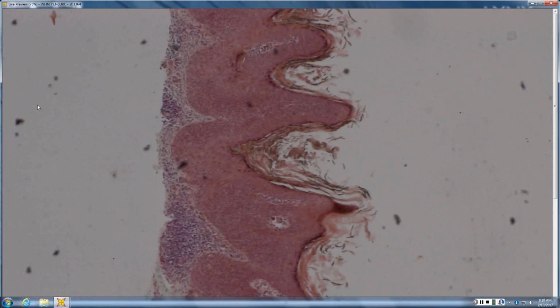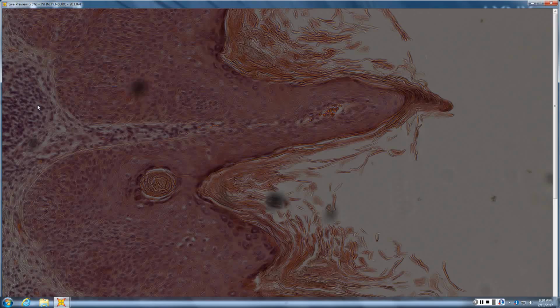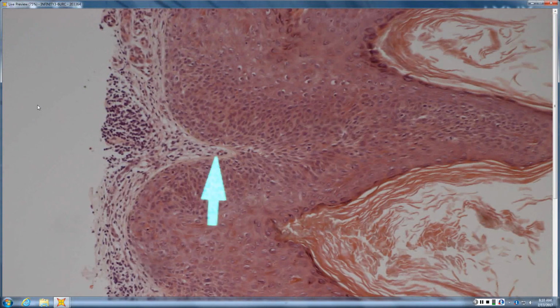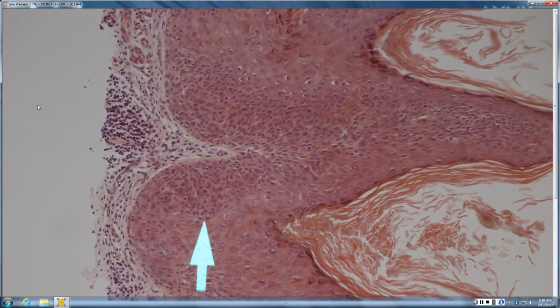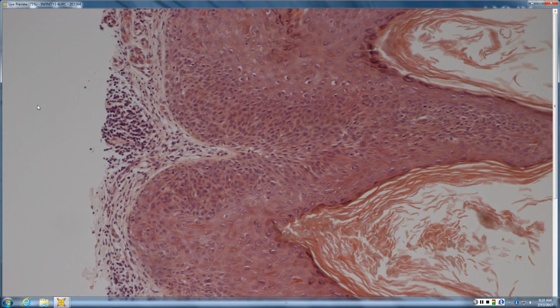Like papillomatous growth. There's inflammation in the superficial dermis. Are all the keratinocytes the same, or do you have two populations of keratinocytes? There's two populations. And is the one in distinct clones or nests? Not really. Yeah, I would have said yes, but that's fine. So I'd say, like here, you've got a pretty normal epidermis, and then sitting within it, you got that nest of the smaller cells. Okay.